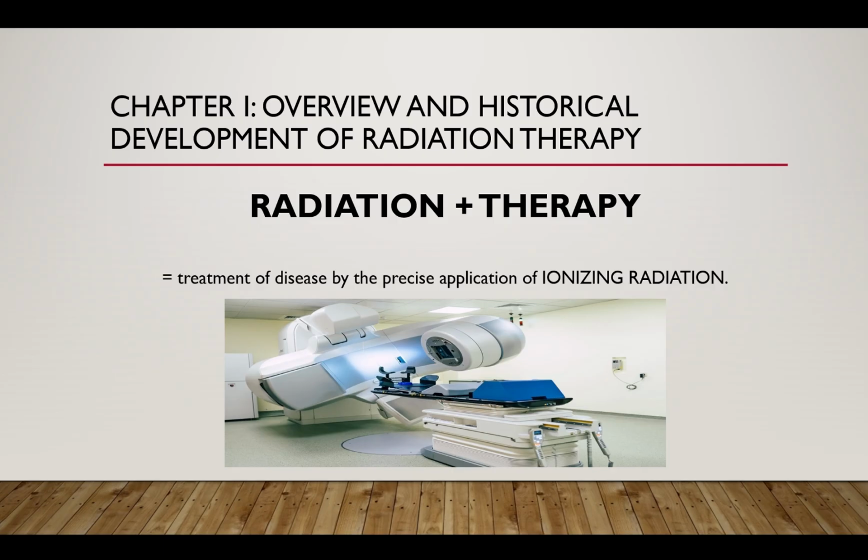So combining both definitions, we come up with a simple definition for radiation therapy. Radiation therapy is defined as the treatment of disease by the precise application of ionizing radiation. So we take note of the words ionizing radiation here. You have to remember that in radiotherapy, we are only constrained to using ionizing radiation.